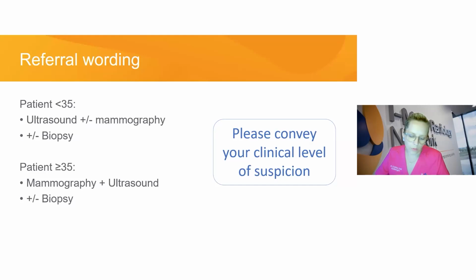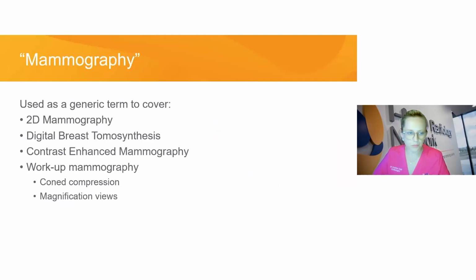And that's often important when we think about Medicare billing, or not billing so much as Medicare indications. There is an indication for a clinically suspicious lesion with no mammographic or ultrasound lesion identified. So if we're in that clinical suspicion area, then the words of my report will enable the breast surgeon to then make the referral for an MRI that Medicare will cover.